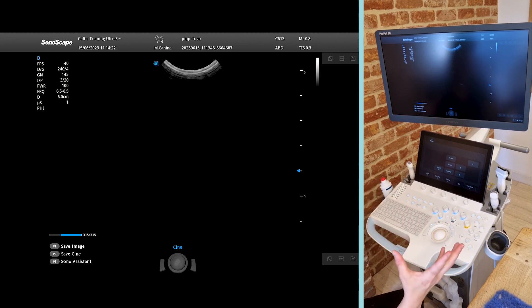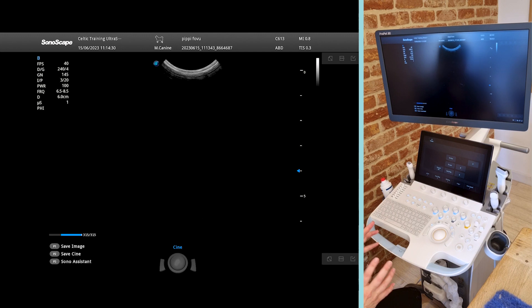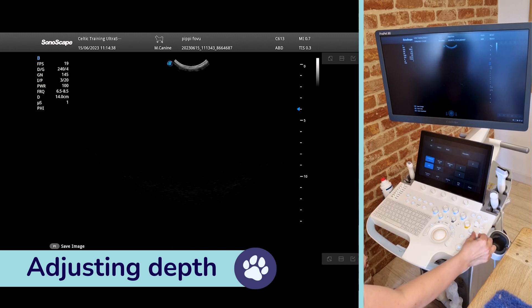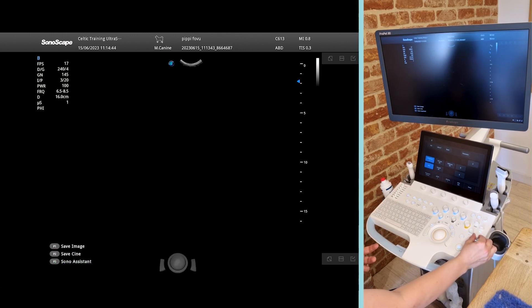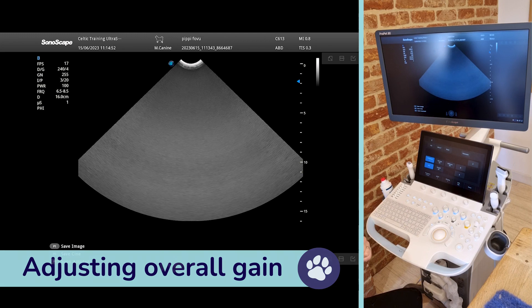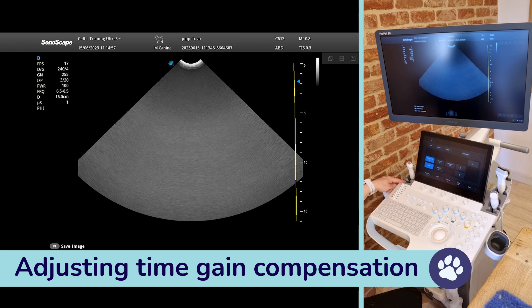Just making the image a bit bigger on the screen by adjusting the zoom button. We can adjust our settings to optimise our image — for example, our depth can be adjusted here. We can go down to very low depth on this Microconvex Probe, or go quite deep. We can adjust our overall gain using the B button to adjust the brightness, and equally we can adjust our time gain compensation using the sliders.